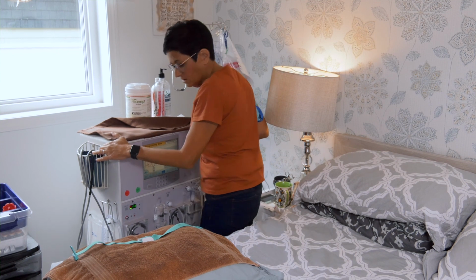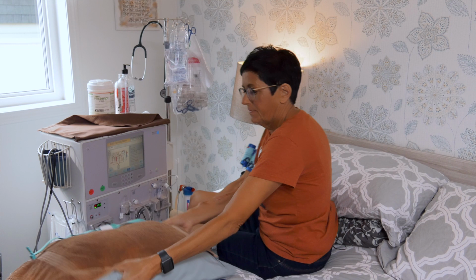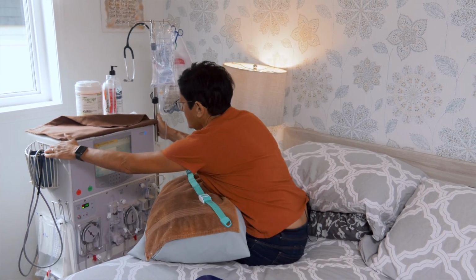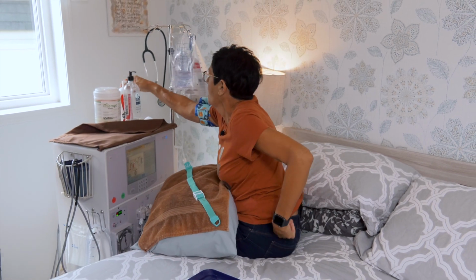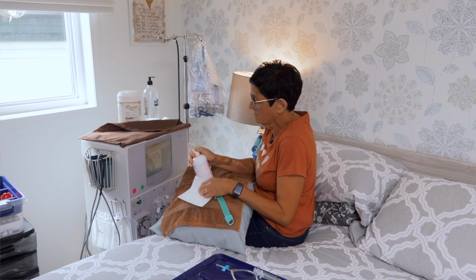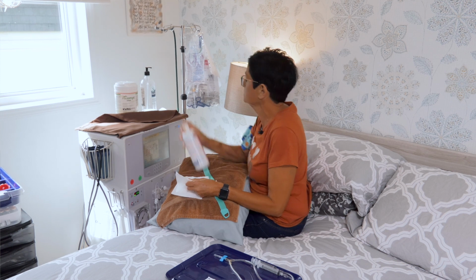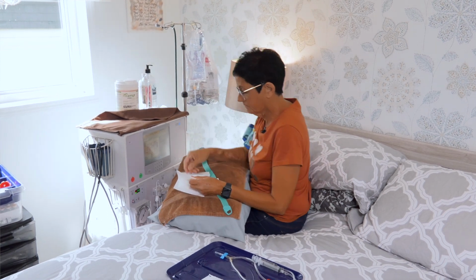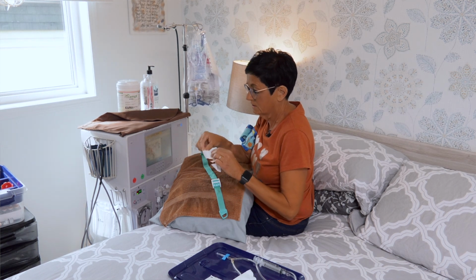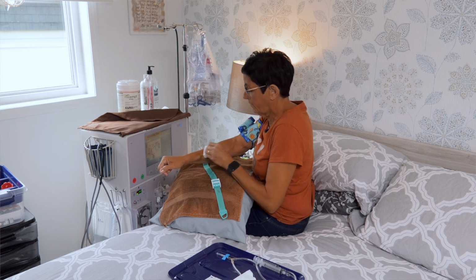Now I pull out my machine close to the bed. Hop up on the bed. There's my tourniquet, nice tourniquet they give you. Easy to use. I cannot use chlorhexidine, I'm allergic to it, so I use the iodine solution. I wasn't always allergic to the chlorhexidine either, it's just after so many years of use, I think. So I'm going to give my arm a good wipe.